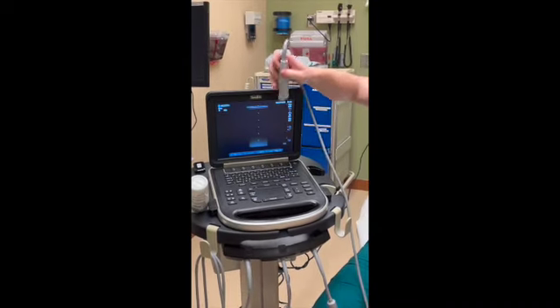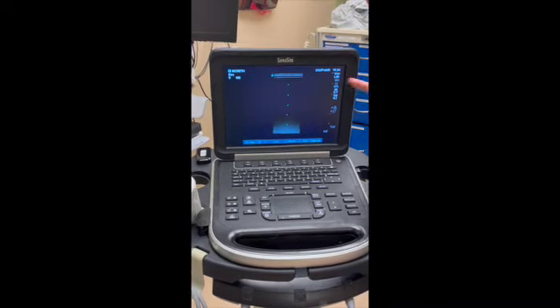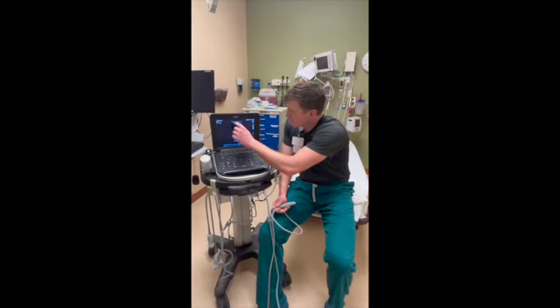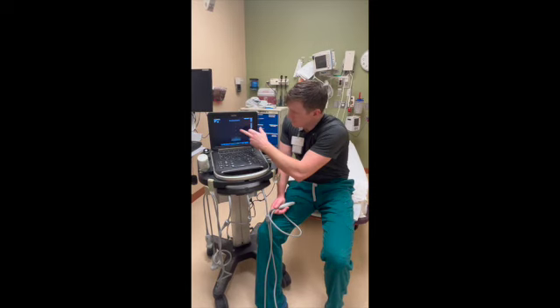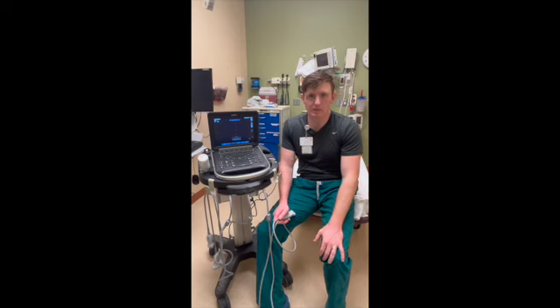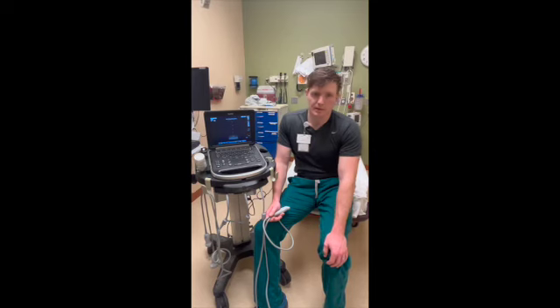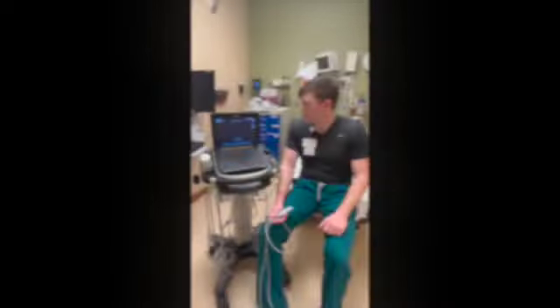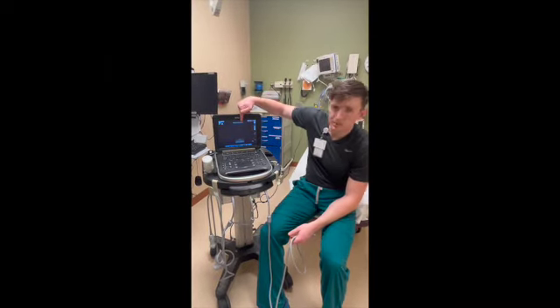Each dot is half a centimeter. Once you're starting to look at depth, make sure that you're poking with the extended tubing no more than one to one and a half centimeters deep, or else you will run out of catheter before you've fully placed the line. This can cause IVs to blow, issues with CT and transfusion, and infiltrates.